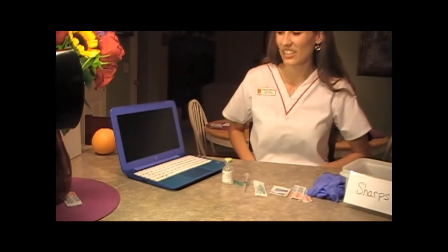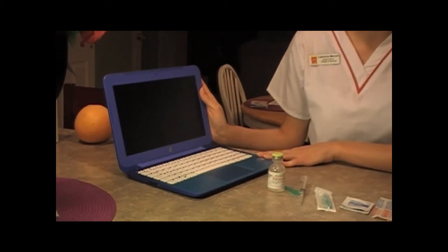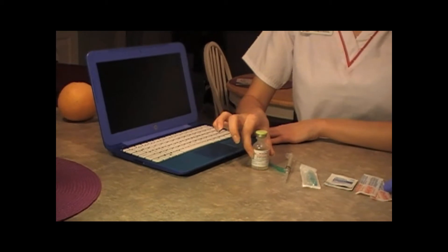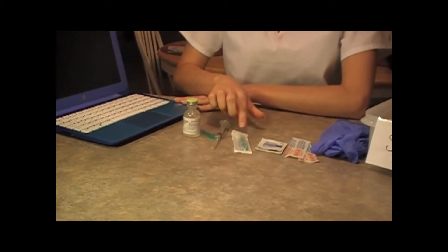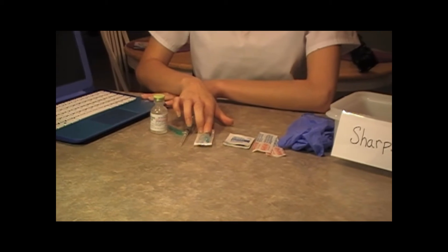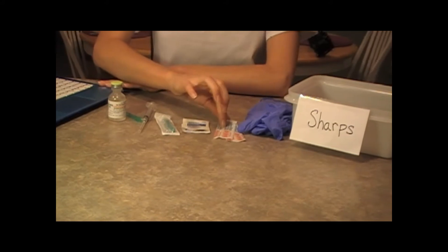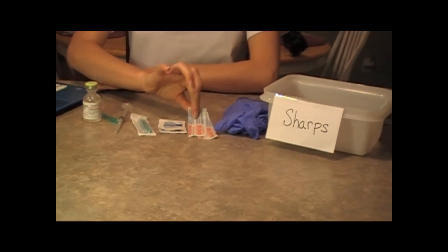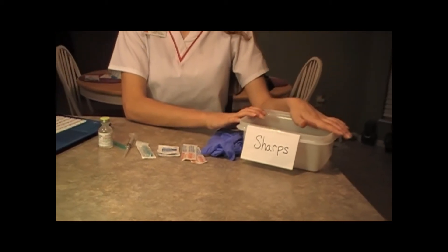The first thing you want to do is make sure you have all of your equipment ready. You want to make sure you have access to your MAR, which provides all of your patient information, your vial of medication, a needle, another needle head, your alcohol prep wipes, band-aids, some gloves, and access to a sharps container.